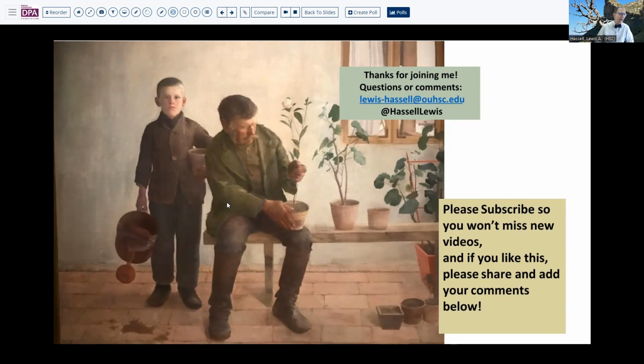Now, I didn't include the immunohistochemistry workup that we would typically include. I'll post that in the comments so that you can refer to that later as well.